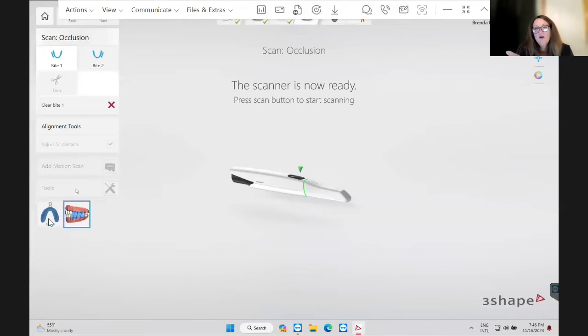And that is really hard because you have to capture those very important landmarks, and sometimes scanning a fully edentulous area, if they have those high vestibular areas, it's better really to take an alginate impression, and then scan that in. That's what I have found.